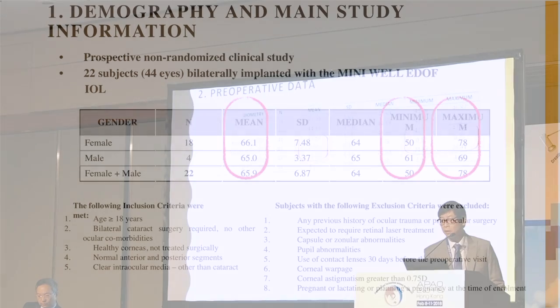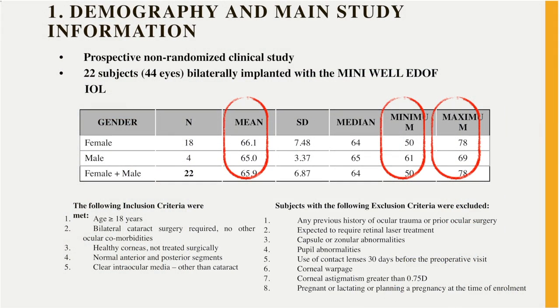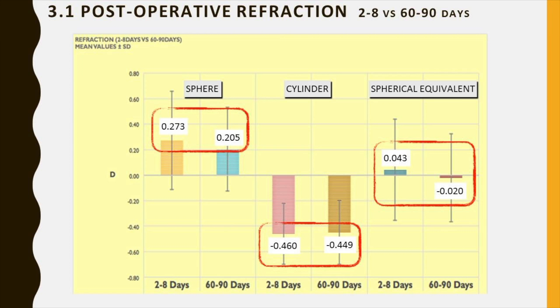The other data, the biometry, is fairly in the normal range. We did limit the astigmatism to 0.75. We didn't do anything higher than that. The subjective refraction and the distance vision pre-op. Here's the more interesting part, the results. So, after surgery, what did we get?